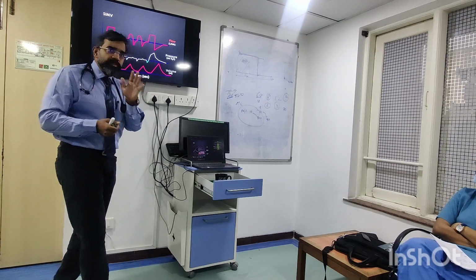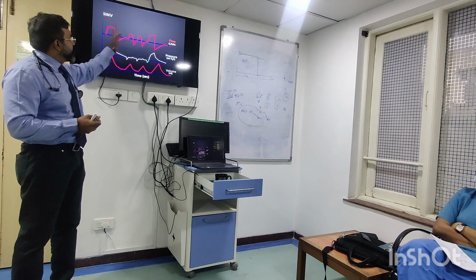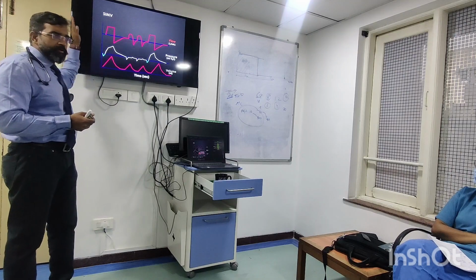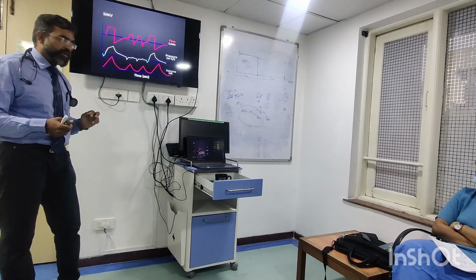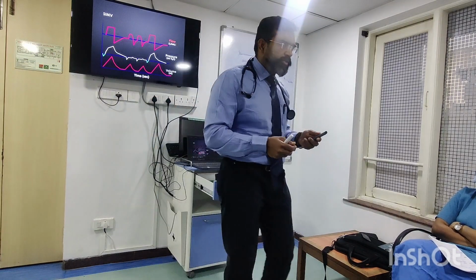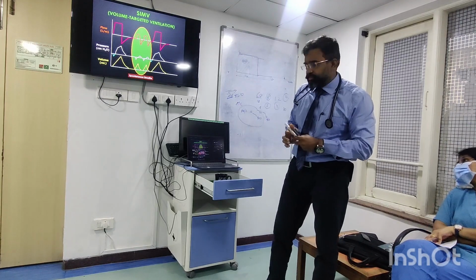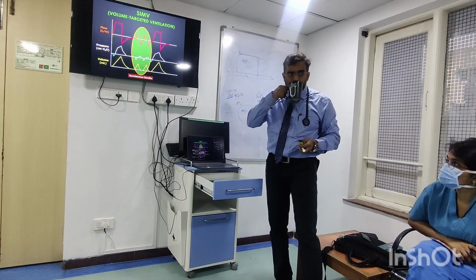So in this there are two kinds of breath. One is the machine triggered breath, and the other is the patient's. There are two types of periods. One period is the mandatory period, and the other period is the SIMV period. Clear? The patient period. Got the point? Clear? There are two kinds of breaths here. Clear? Alright. Now, this is your spontaneous breaths. Okay, in the spontaneous breaths the patient can do whatever the patient wants to do.